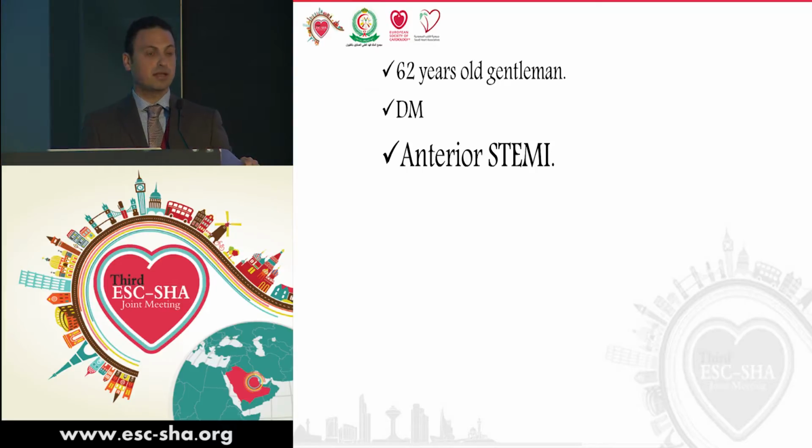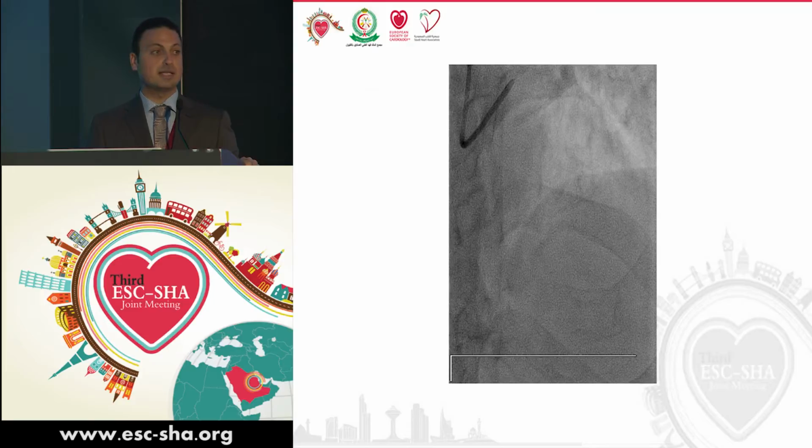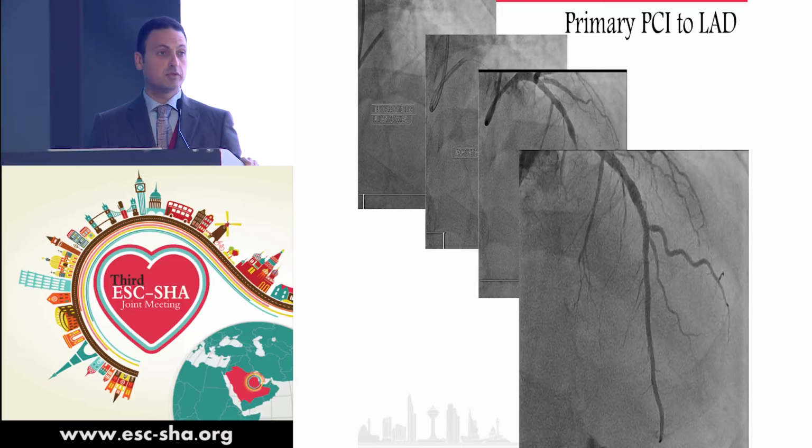The patient was taken directly to the cath lab where we found this RCA distal lesion and some retrograde filling to the LAD. And as expected, the LAD is totally occluded at its mid segment. So we proceeded with PCI to the LAD. First wire, then export catheter, which we still use in most cases of STEMI, and restoration of flow. Then we had a good result after stenting and post-dilatation.